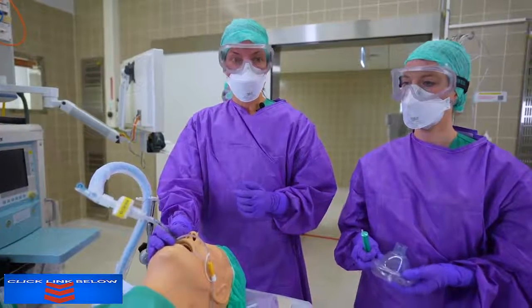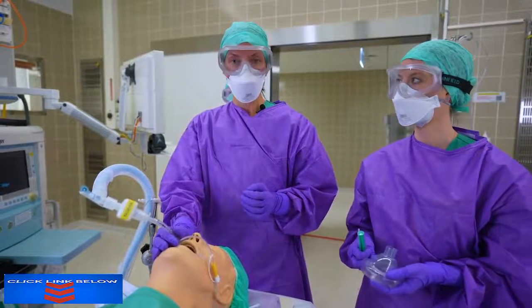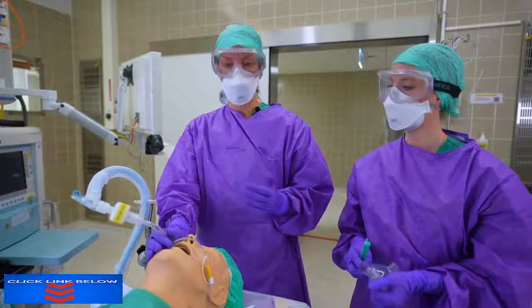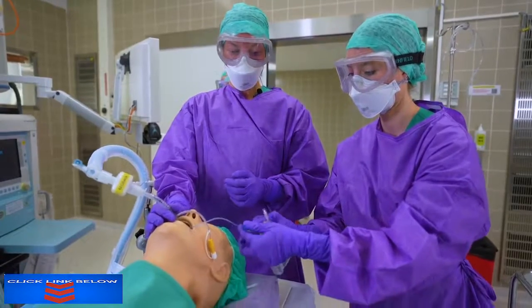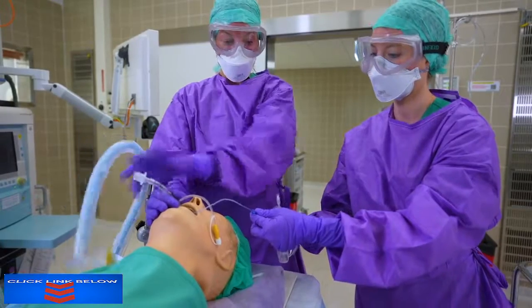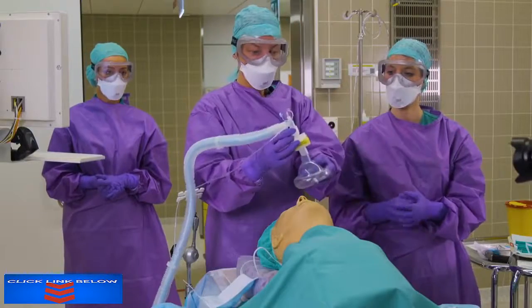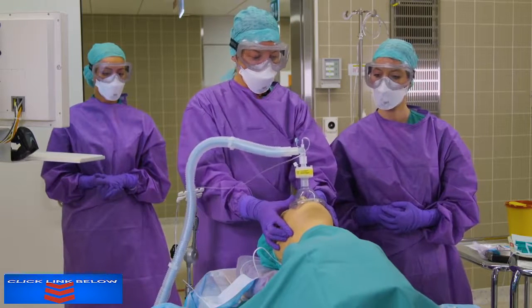It is important to avoid coughing when you extubate the patient. Here, IV lidocaine or remifentanil come in handy. When you extubate, you're not utilizing positive pressure, but rather you're deflating the cuff and pulling the tube. We dispose of the tube right away and oxygenate the patient with a tight-fitting mask.